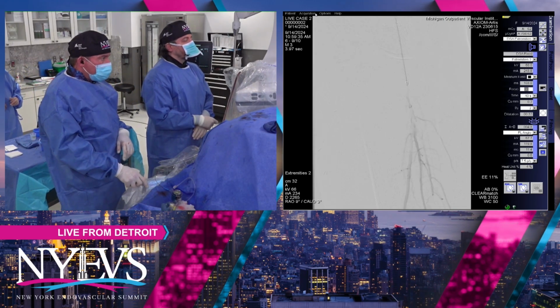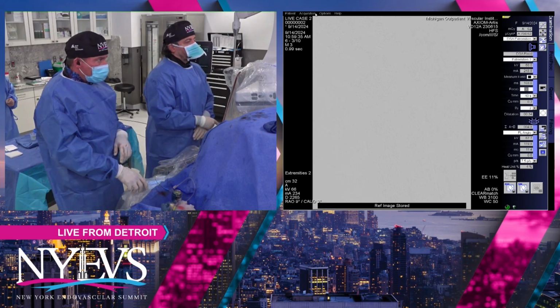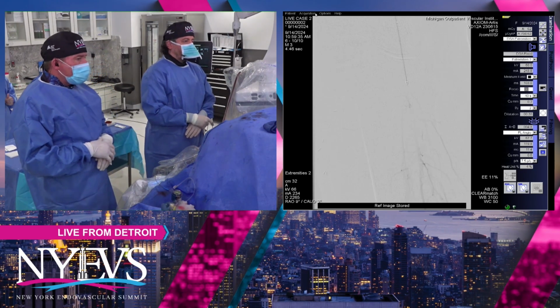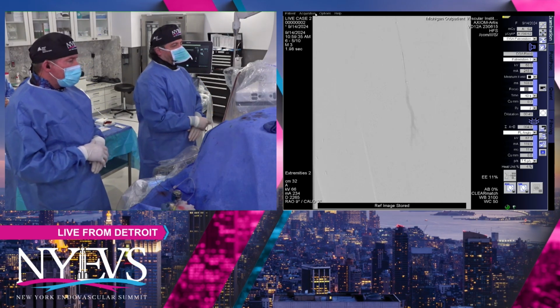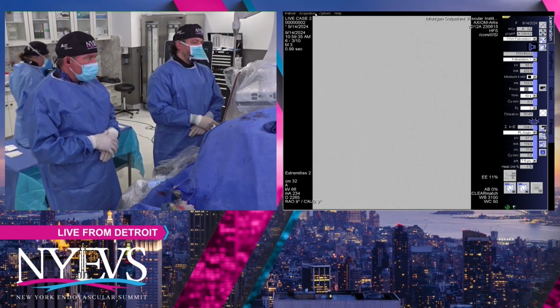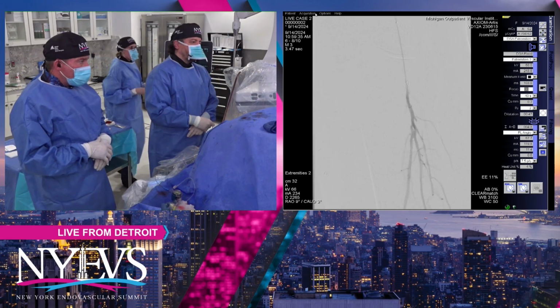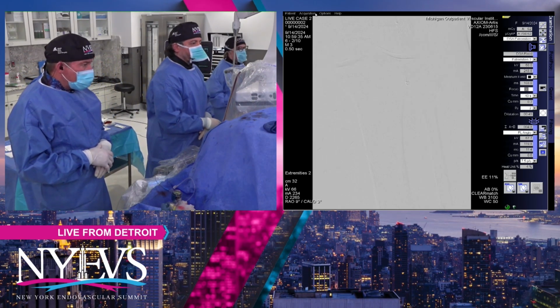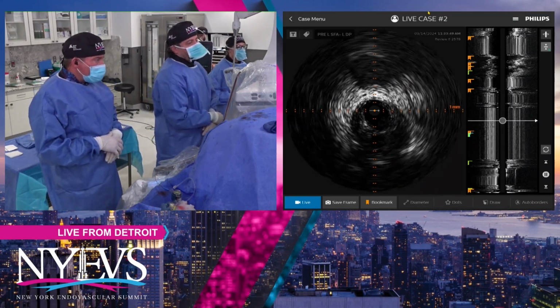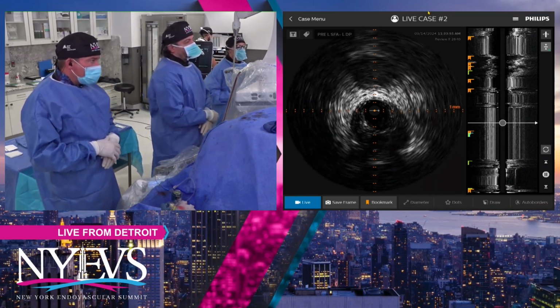Do you have specific concerns about certain modalities being more or less safe? Well, I was just thinking, if this is thrombotic and I use a mechanical device, in my mind I divide them that way, so it might be disruptive. This is probably a fragile area here. It measures almost 6 millimeters in the proximal anterior tibial artery, so definitely not normal. I'm going to balloon it and we'll see how it looks.